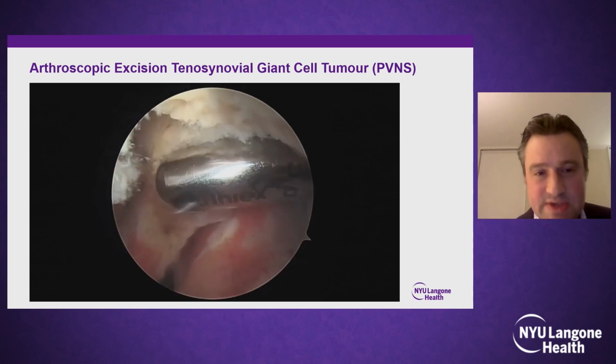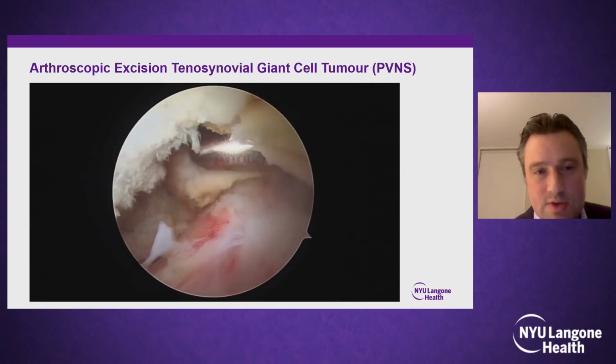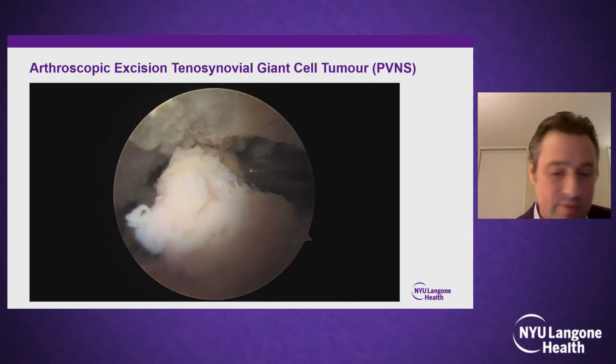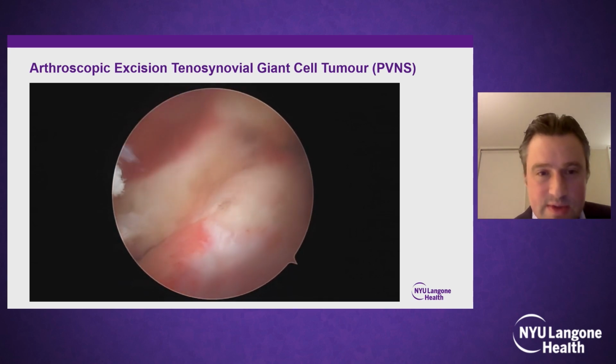Biopsy taken. You can also send shavings. These can take quite a long time to fully resect, but it's important to really work to get the entire lesion resected to minimize the risk of recurrence. And then there we see the femoral neck with the entire mass excised there.